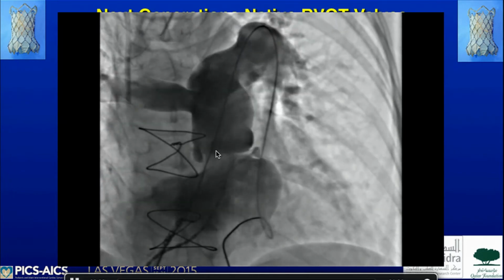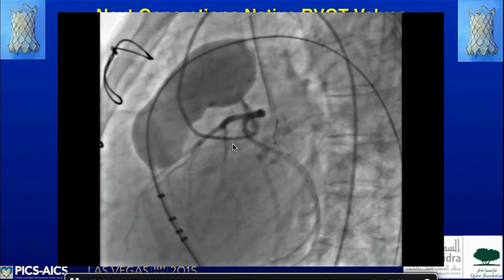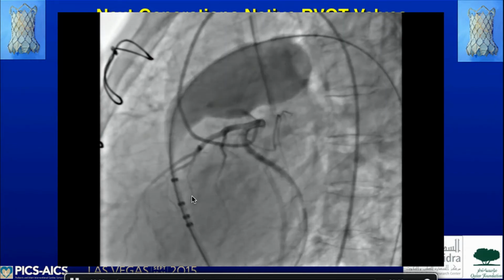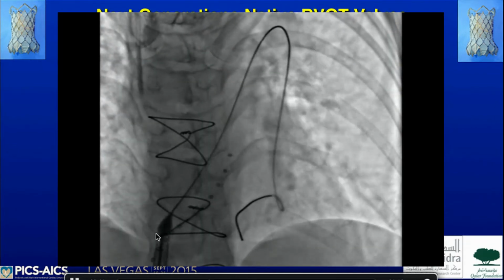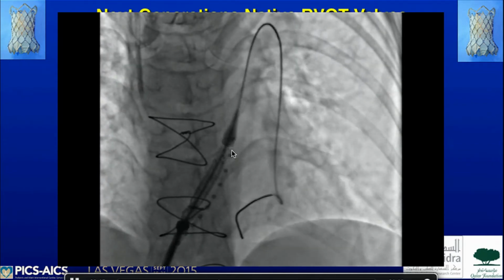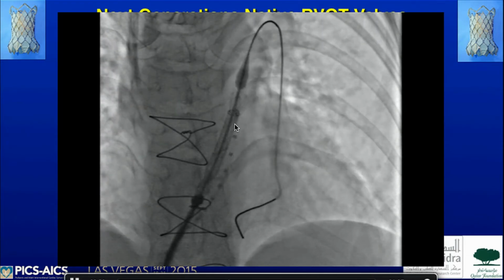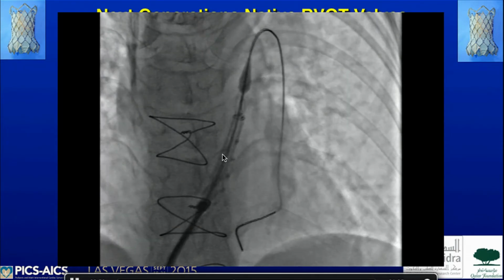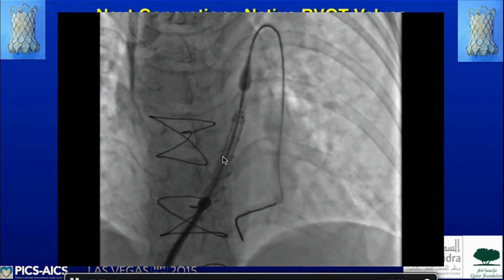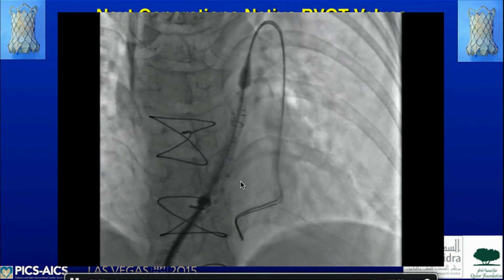Still, we do coronary injection to make sure that the coronaries are far from the outflow tract, like shown in this picture. The valve is coming over this super stiff guide wire. Another catheter is placed from the contralateral femoral vein for control angios during positioning. You can deploy more than half of it, and then if you're not happy with the position, you can recapture most of it or move it. And then finally, once you are happy with the position, you can release it.